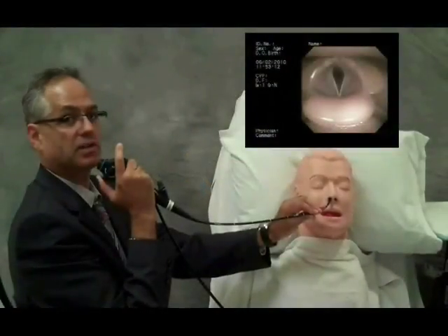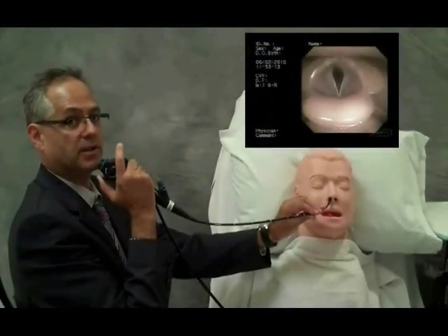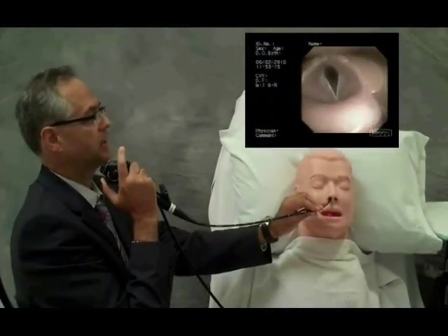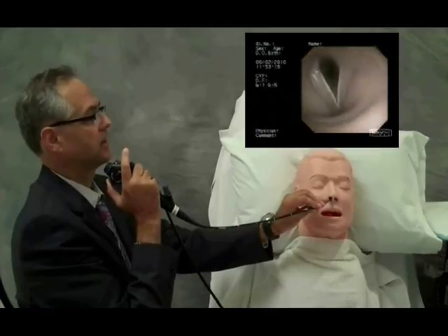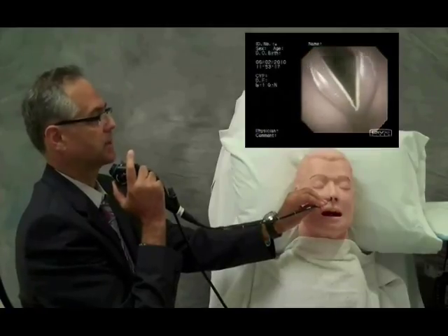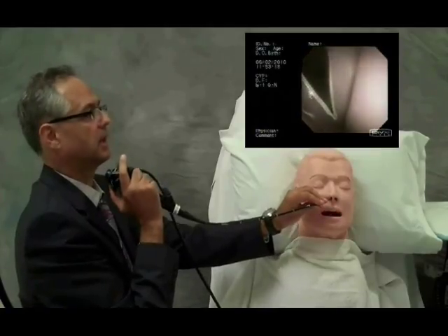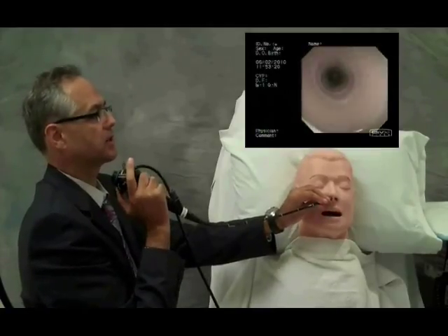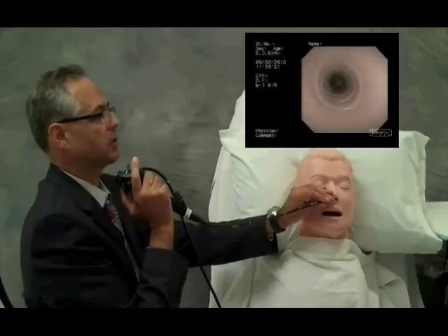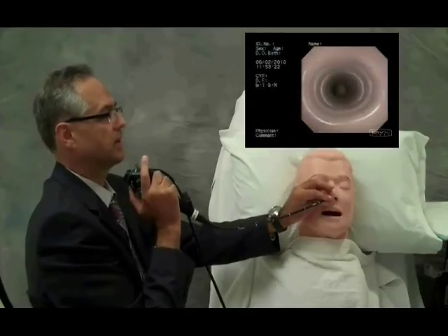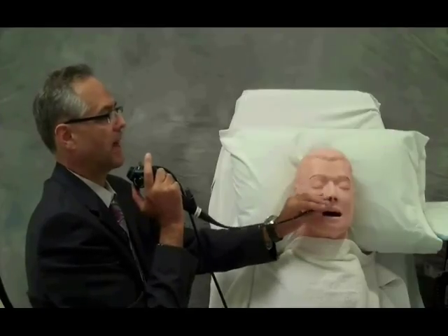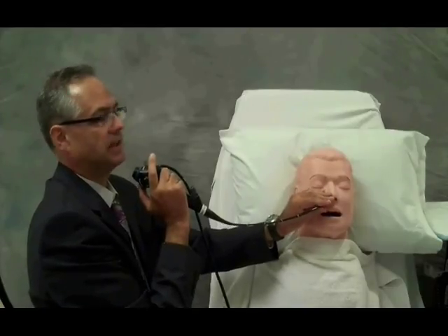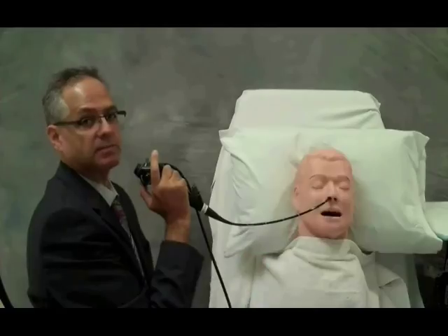Step 2 will move the bronchoscope into the subglottis. As the patient inhales, the bronchoscope is kept in the midline and slight manipulations are made to keep the scope centered as it passes beyond the vocal cords into the subglottic space.